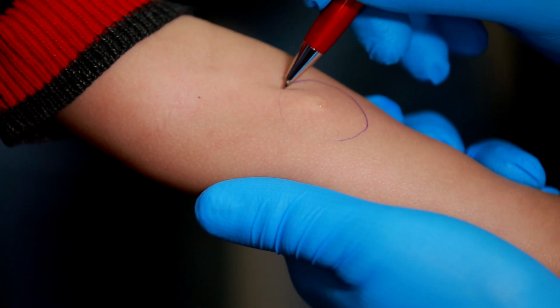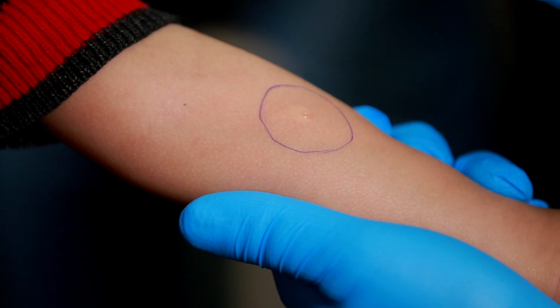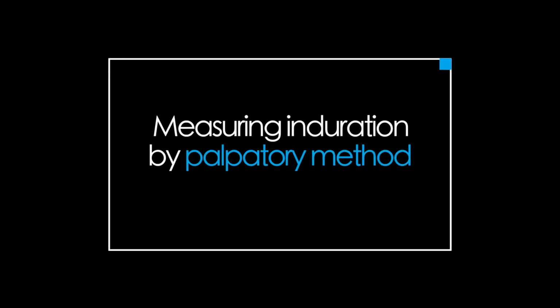Record the date, time, and site of TST administration. The patient should be advised not to scratch the site. The patient should be asked to return for a reading of the TST between 48 to 72 hours. Induration can be measured by the palpatory method.